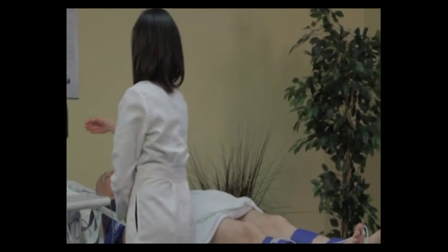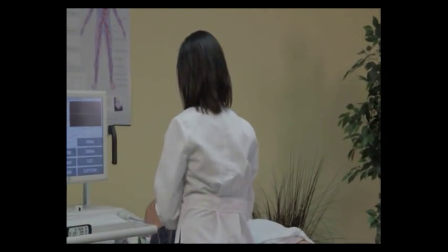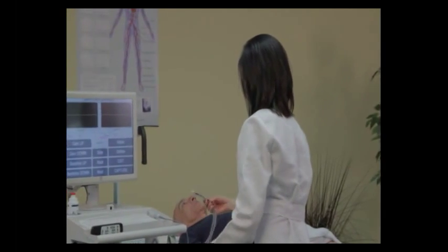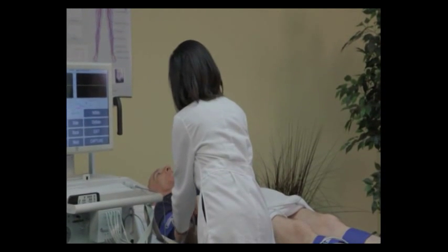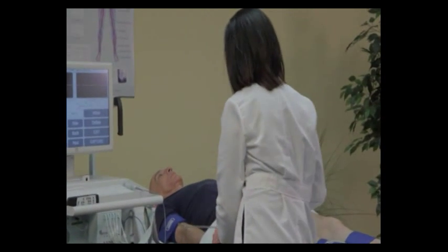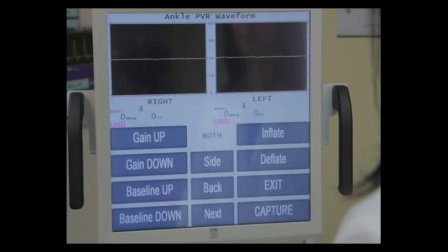A good rule of thumb is to put the tips into the cuffs gently, and when you remove them after the exam, remove them with just one hand. If you can't remove them with one hand, you've inserted them too tight. We're now going to demonstrate taking PVR waveforms.